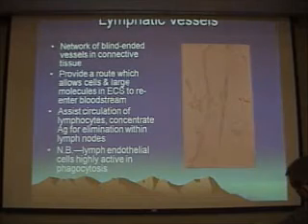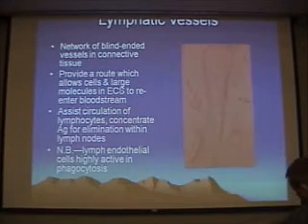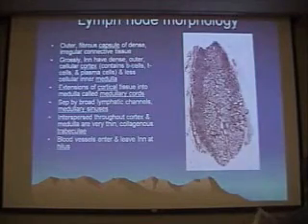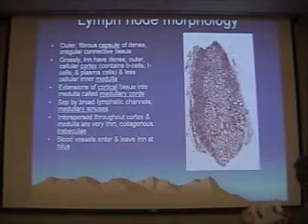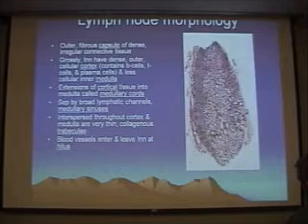Okay, lymphoid organs. Lymphoid organs, remember, have lymphatic vessels which supply them. We've already talked about those. The first lymphatic organ you should be able to identify is a lymph node. Lymph nodes are characterized by an outer cortex, inner medulla. That cortex contains primarily B cells. Remember, most lymphoid tissue is aggregates of B cells.